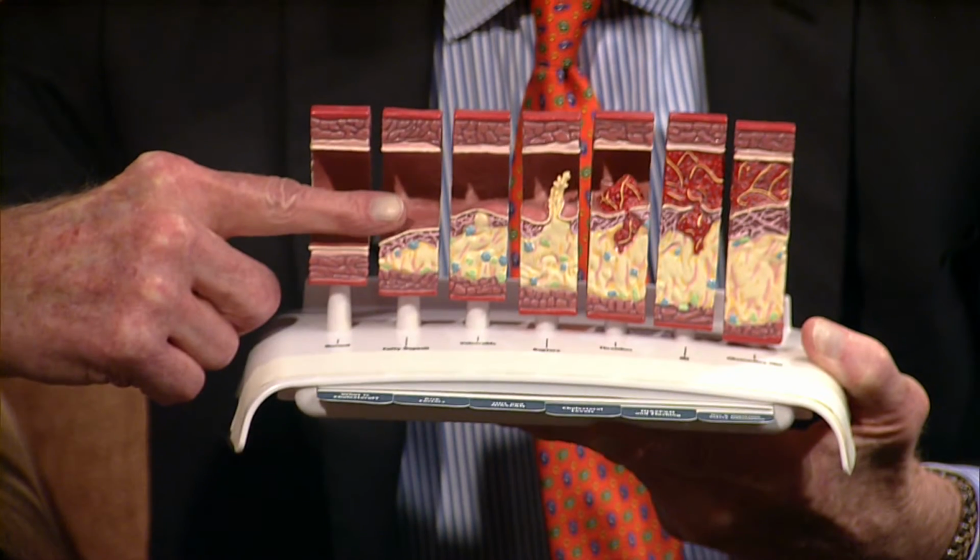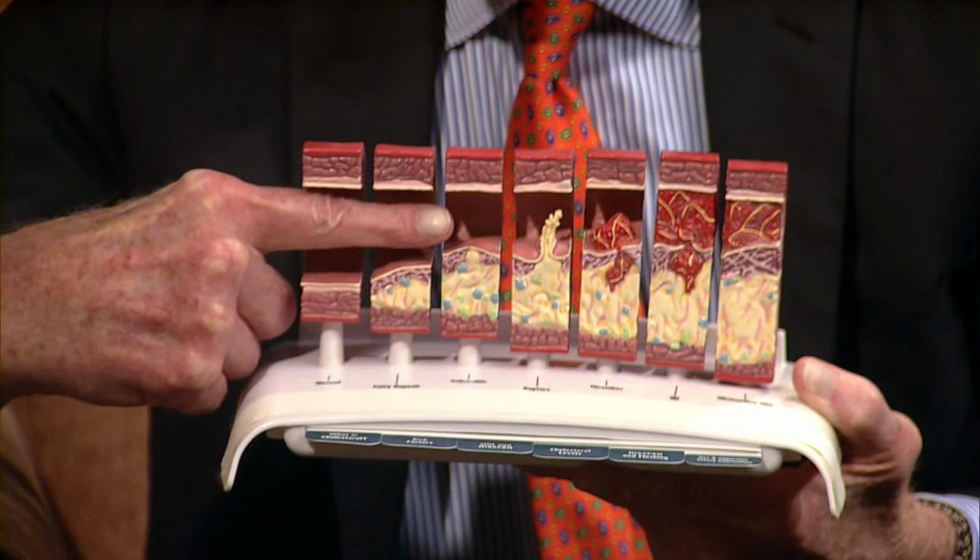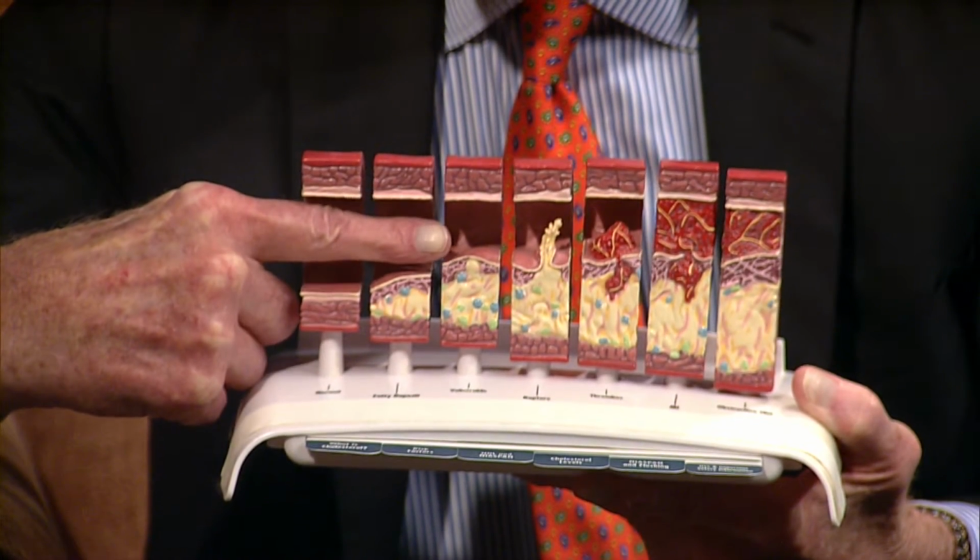We're talking with Dr. Malcolm Foster, board-certified cardiologist, and we've been talking about heart caths. Now, what I have in front of me here is a picture of an enlarged coronary artery. You can see right here there's a wide open hole, a little plaque, more plaque, more plaque. And apparently you can put a catheter in here and place a stent in there. Malcolm, show me what a stent looks like.